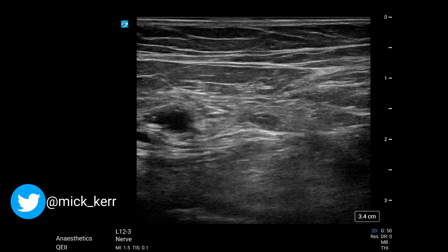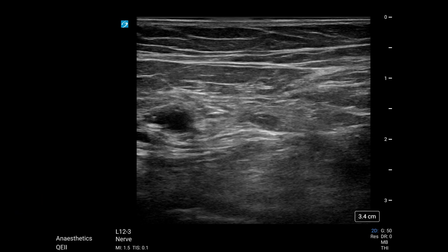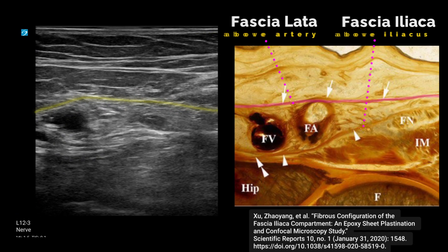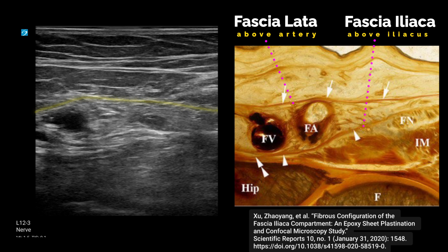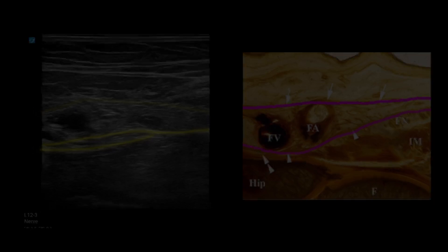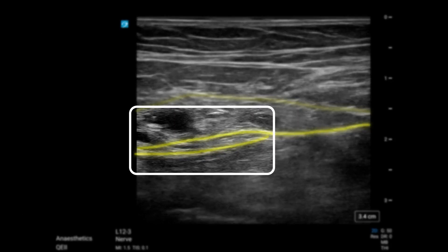So when you can't reliably find the nerve, you can use some of your knowledge of fascial anatomy to help identify a likely target. We know that the fascia lata is superficial with the artery below it. We also know that the fascia iliaca separates the artery from the nerve in this location most of the time. So we're looking for a fascial line below the artery and above the iliacus muscle, and we often see an enveloping of the femoral nerve, which we can see here.